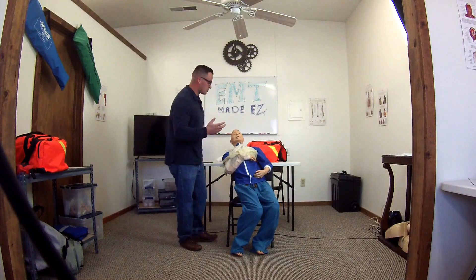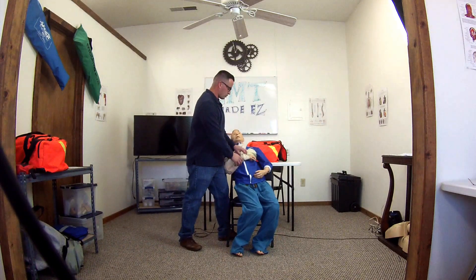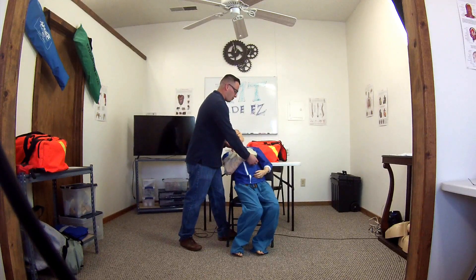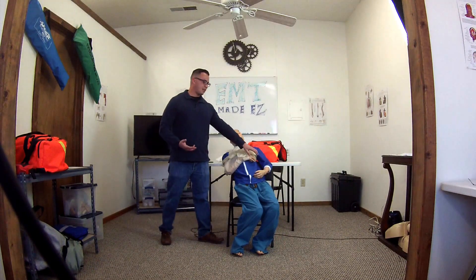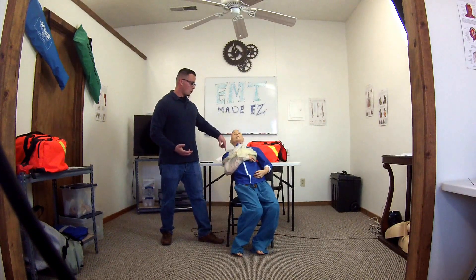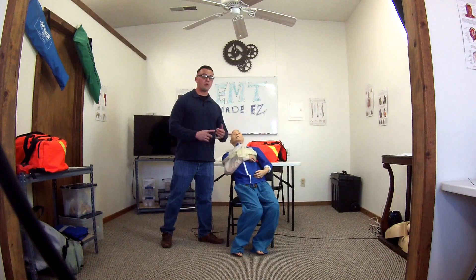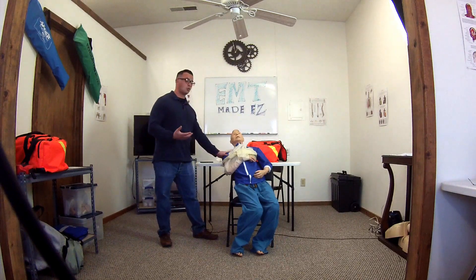The last part is to recheck your CMS. Check for a pulse — is my pulse present? It is. Motor — go ahead and squeeze my fingers. Sensory — which finger am I touching? The pinky. And you're done with the scenario. By checking CMS, you're making sure there is still circulation going through the arm. What I forgot to mention earlier is when you initially check CMS, if there is no pulse, motor, or sensory, that's the only time you may want to consider putting that joint back in place.